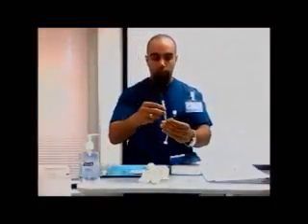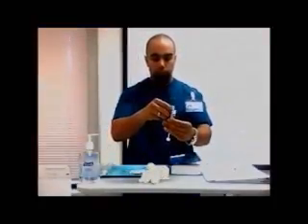To prepare the medication, twist the base of the carboject to the left to unlock it. Pull down on the plunger and insert the pre-filled medication so that the medication label is visible. Then twist the base of the carboject to the right to lock the syringe in place.